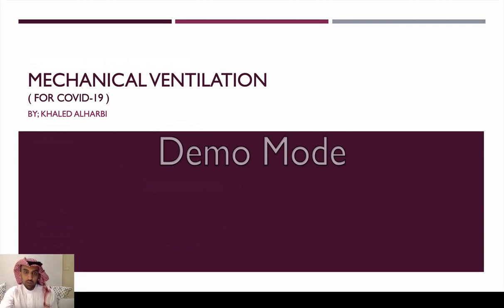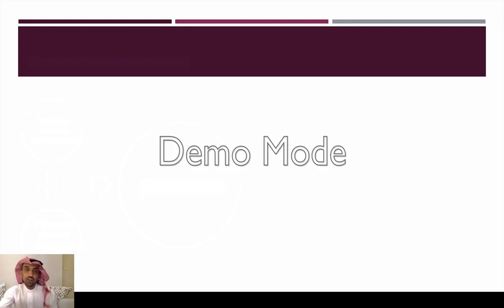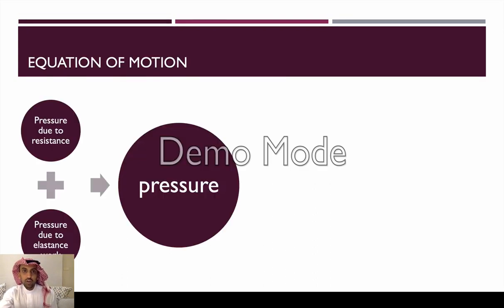So when we're talking about invasive mechanical ventilation, an important thing to consider is the equation of motion. In a spontaneously breathing patient, the pressure that is generated to take a breath is a negative pressure, and it needs to overcome the pressure due to resistance plus the pressure due to the elastance work of the lungs.